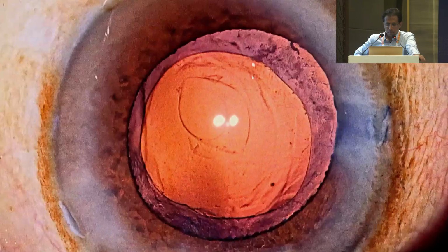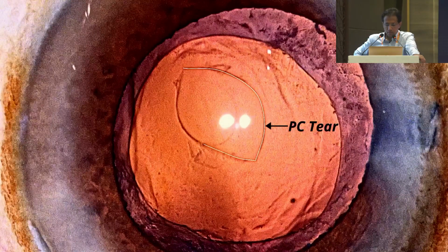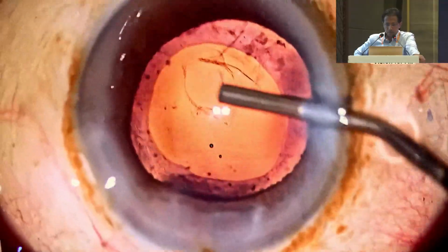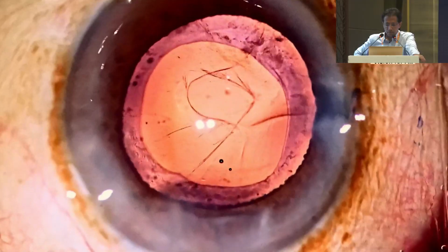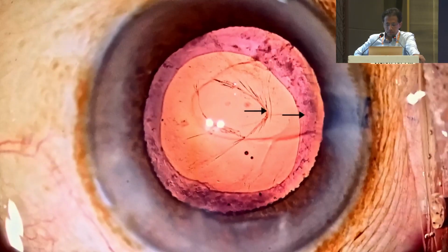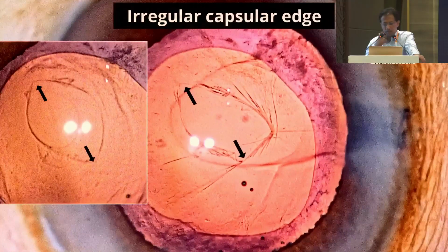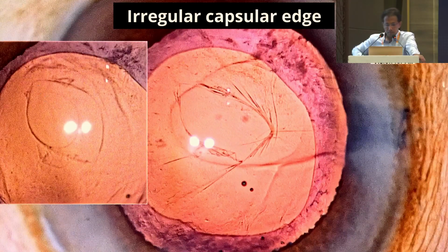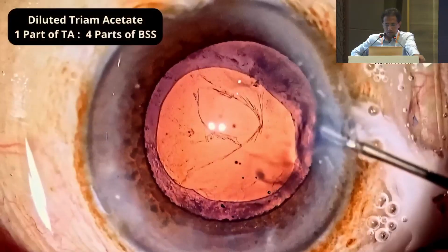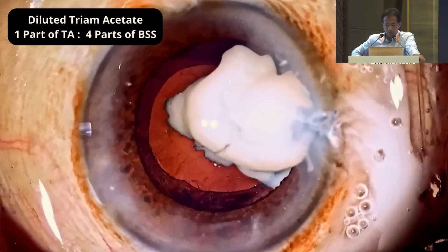Case number 2. The posterior capsule is broken. We can also see an inner ring, and this is the ruptured anterior hyaloid. As the OVD is being placed into the antechamber, we can see the prolapsed vitreous finding its way towards the side port. The edges of the capsular tear are irregular and are at risk of running away during vitrectomy, thus increasing the chances of posterior capsular tear enlargement.